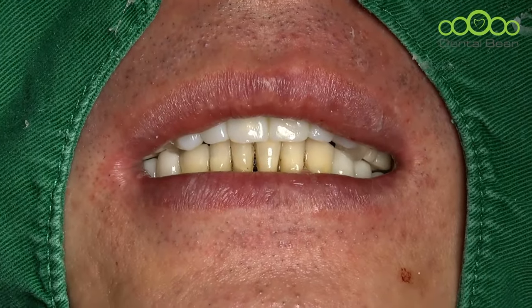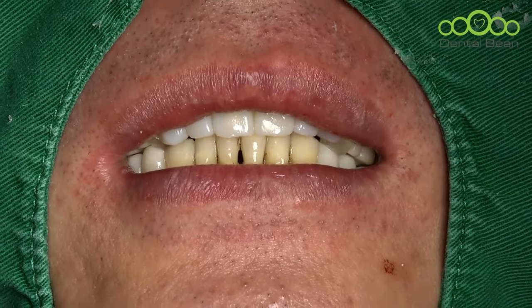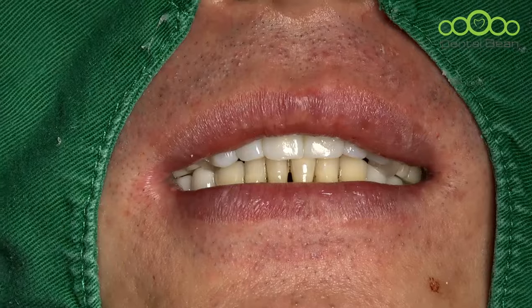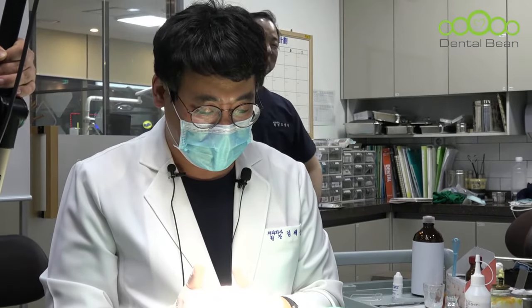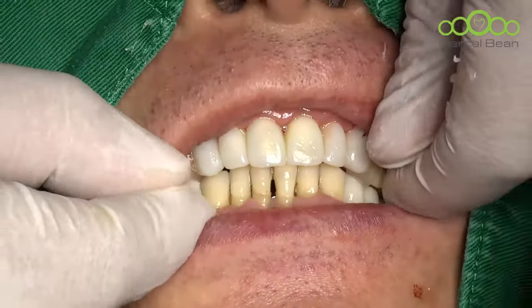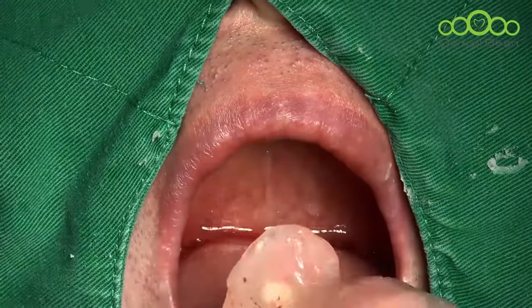As I told you in my presentation, when the initial stability of the implant is very poor, and in a case like this, when we performed a large amount of bone graft, it is good to deliver this kind of temporary denture after applying the soft liner. And then, again, please keep in mind this soft liner should be exchanged every 2 weeks to protect the implant site and bone graft site. Please keep in mind.